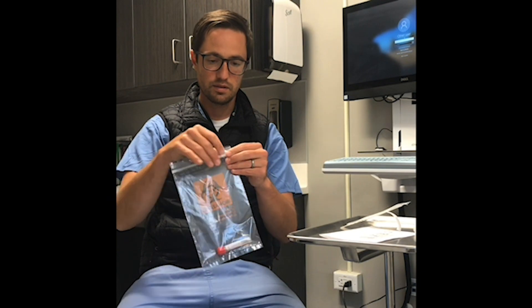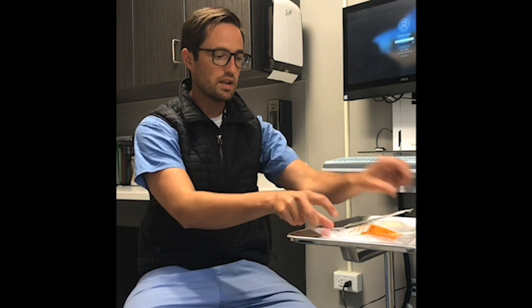Place your sample into your bag, seal it, and leave it on the stand. Wash your hands and you're good to go. Thank you, be well.